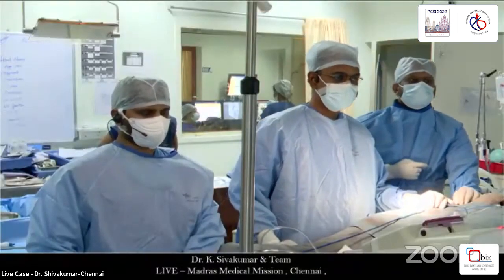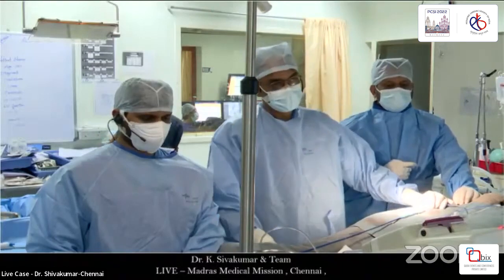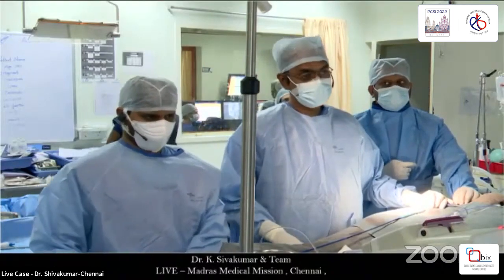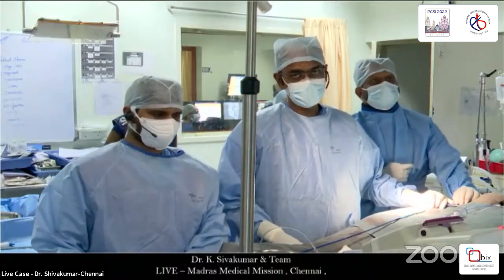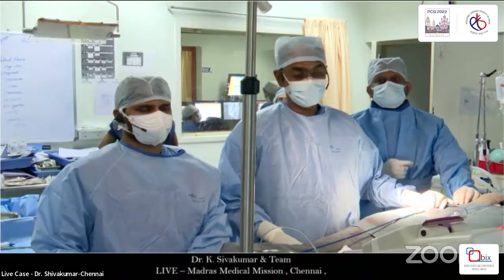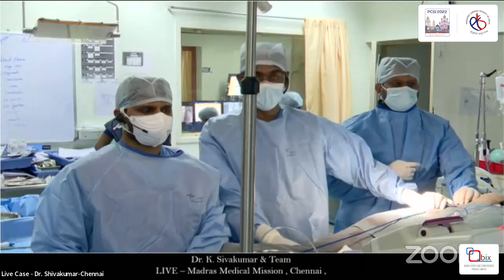Dr. Bharat, I think you heard the presentation. This boy has quite a dilated right ventricle, more than 3 times the left ventricle. He is satisfying the volume criteria, and he's satisfying the regurgitant fraction criteria. He has class 2 effort intolerance, symptomatic as well.